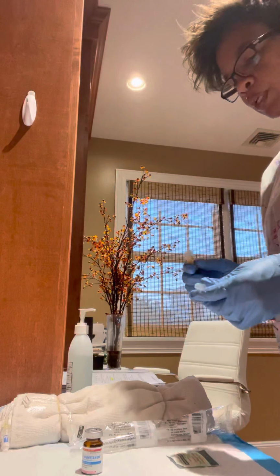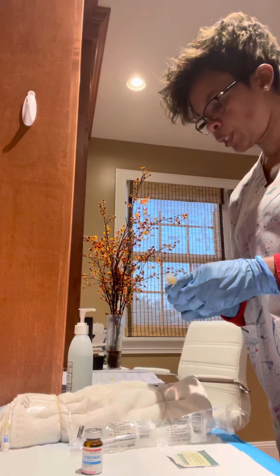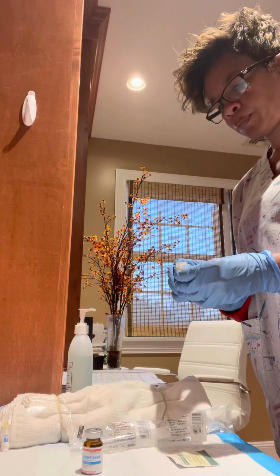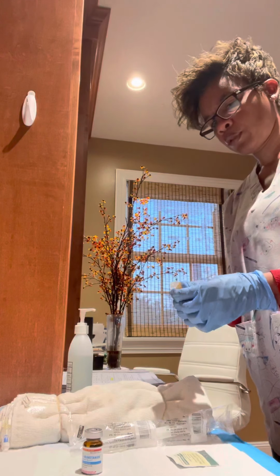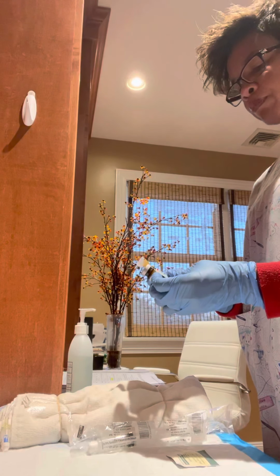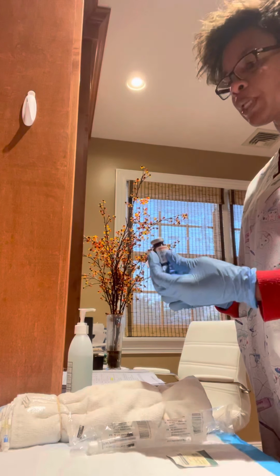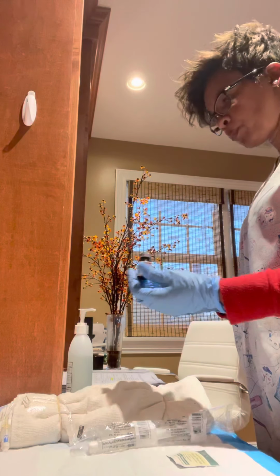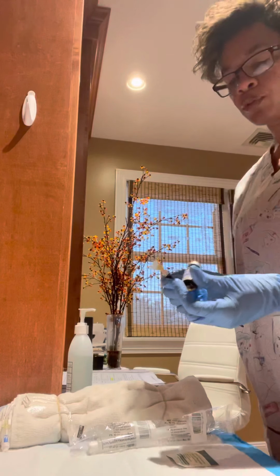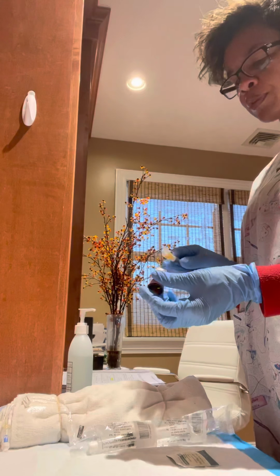I'm just going to remove the safety device, and I would be using a 22 gauge needle. So to make sure it's locked in place, and then I'm also going to look at the medication again, where it does say bumetanide, and I would have told her that she's getting this medication because we want to pull fluid out because she has edema and also hypertension. So I would be explaining that to her.